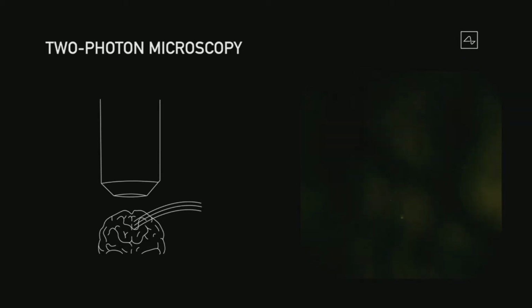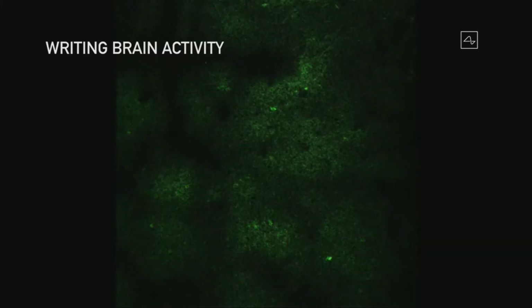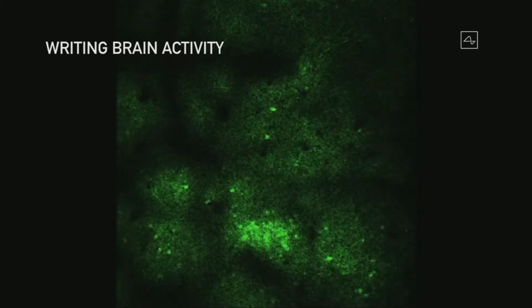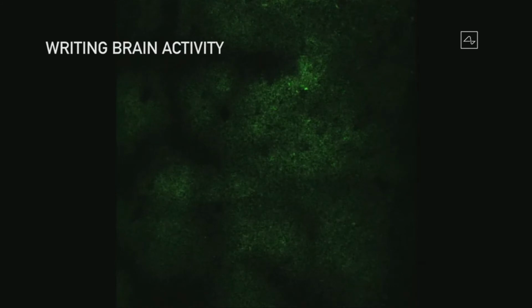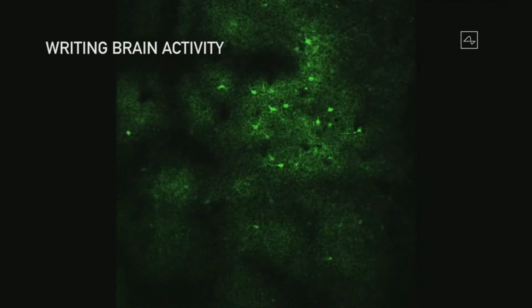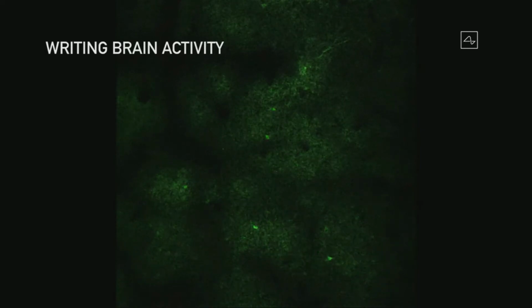Part of the way we analyze the stimulating neurons is with 2-photon microscopy. I always have trouble pronouncing that, microscopy. It's very impressive technology. You can literally see in real time how the neurons are firing. The red flashing things are the electrodes firing, and then the green are the neuron bodies responding to the current from the electrode. So you can see them lighting up different brain regions. And by carefully controlling the electric field, you can have one electrode influence possibly 1,000 or 10,000 neurons. So although you might only have 1,000 electrodes implanted, you could be influencing millions of neurons.